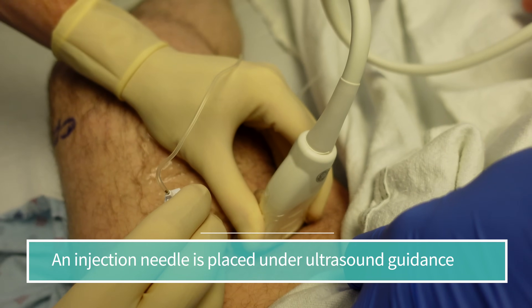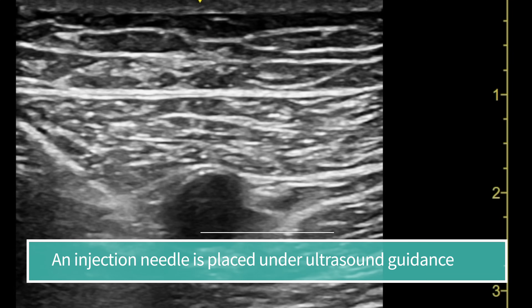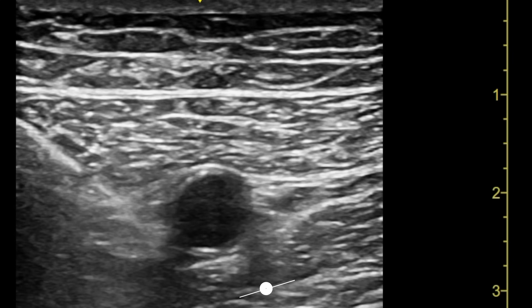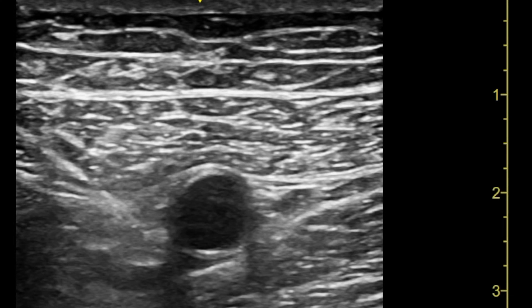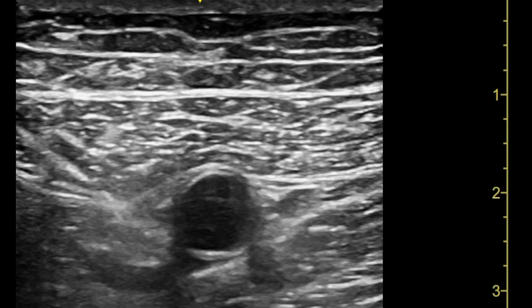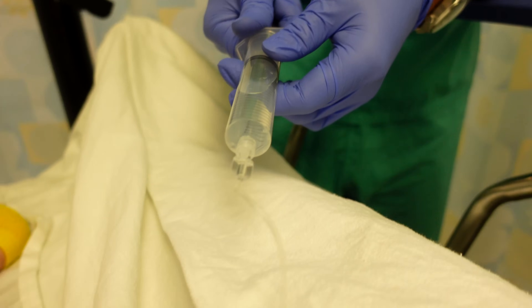Big pinch — and you're going to see the needle come up on the left side of the screen. Right now it's traversing through the sartorius muscle, and our goal is to go right under it. He's going to get really close to the artery, so he's going to aspirate to make sure it's not within a vessel.